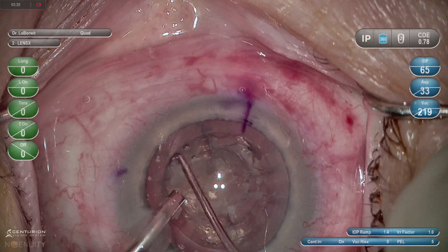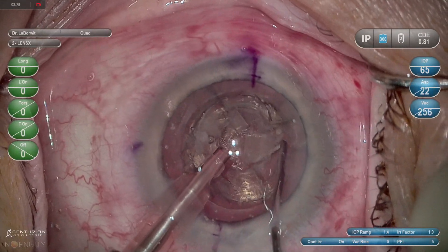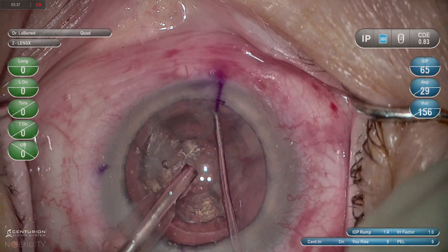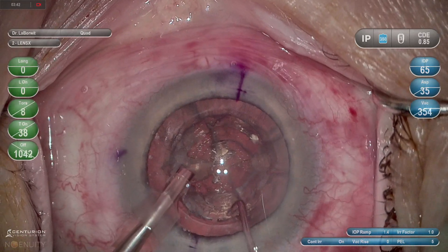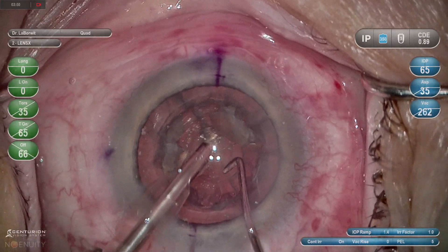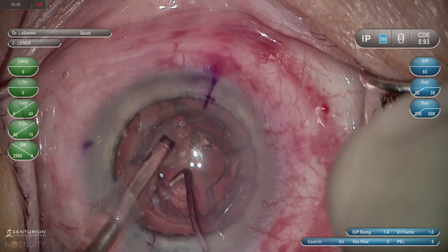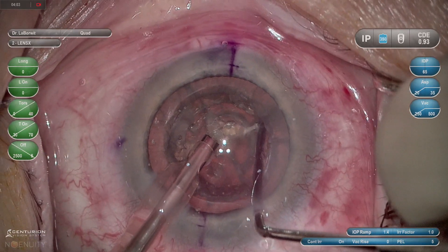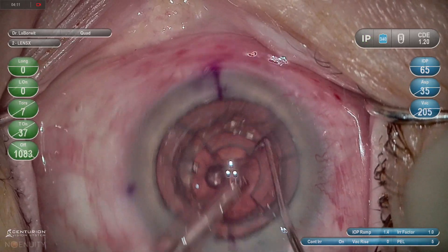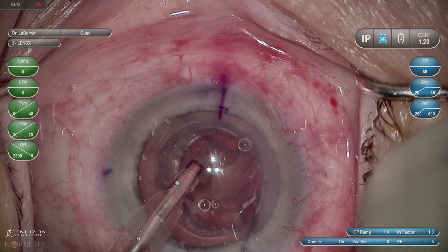This is a denser lens and I'm able to crack the central plug and remove it by manually having the second instrument flick pieces up to the phaco tip. Notice during this case again that the phaco tip stays central and does not extend beyond the capsulotomy, remaining at the iris plane — serving more as a trash can. Once you get a few initial pieces it starts to collapse on itself as you remove the other pieces within the core area. The chop pattern will allow you to further crack the lens and get more pieces as well. I'm confident placing my second instrument deeper because I have the horizontal plane telling me how deep I am inside the lens, and the active fluidics keeps the chamber solid for ease of removal.